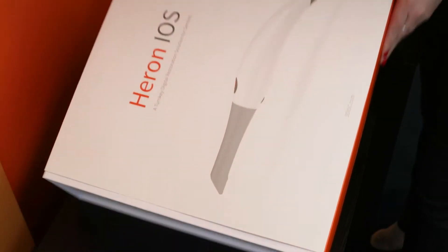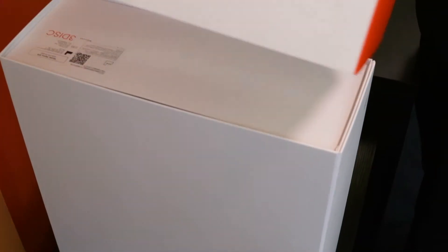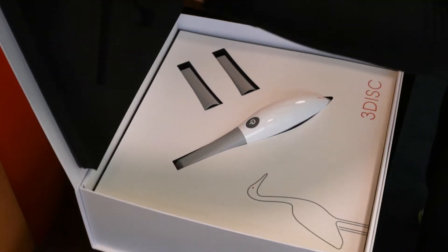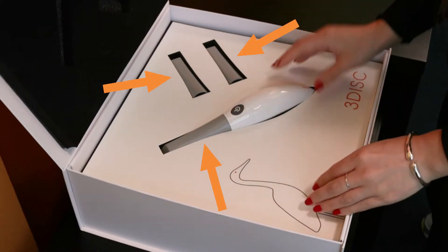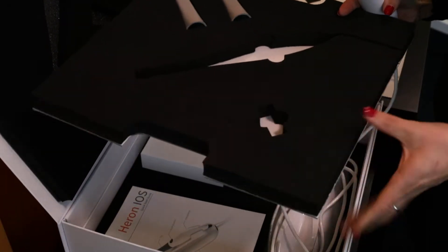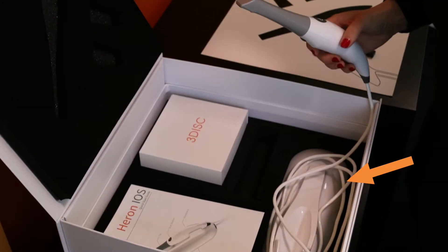To begin setting up your Heron IOS, slide off the outer sleeve and open the box by the magnetized tab. You will see your Heron IOS unit with three scan tips — one tip is on your unit with two spares. Remove the scanner and lift out the foam insert, and you will find the base of the Heron IOS and a quick start guide.